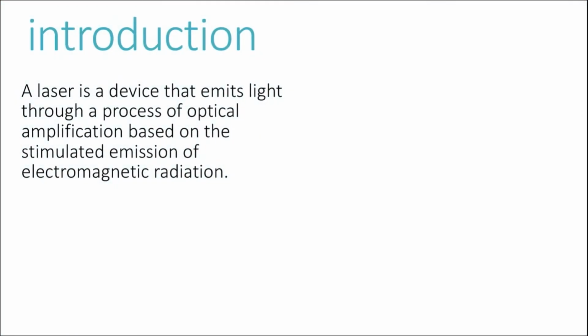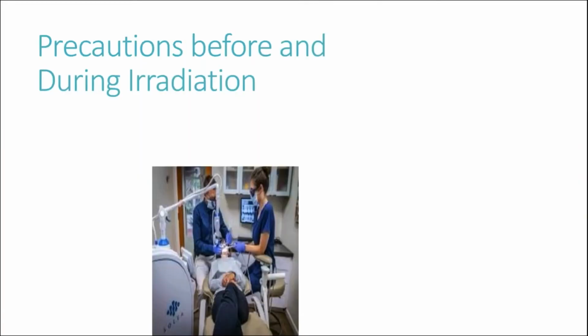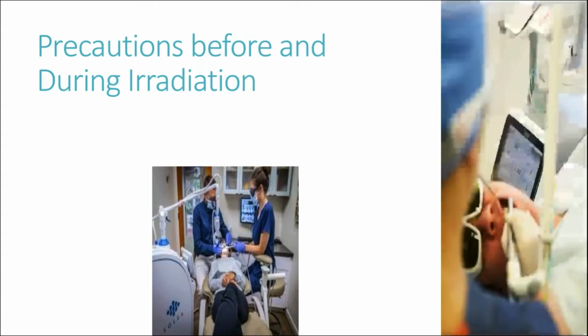A laser is a device that emits light through a process of optical amplification based on stimulated emission of electromagnetic radiation. First, we must use eye glasses for eye protection for the patient, operator, and assistant to prevent radiation.